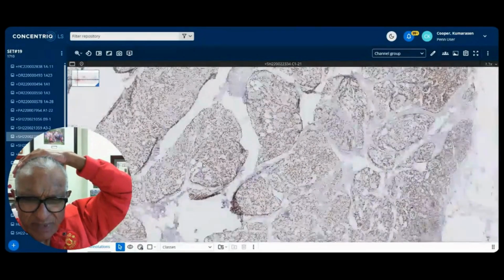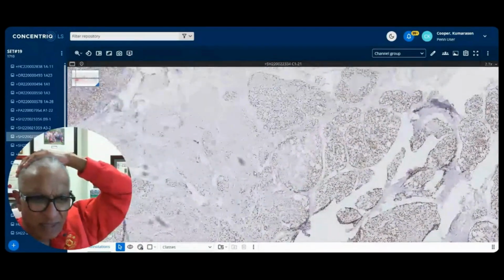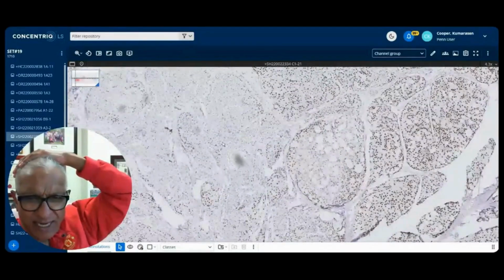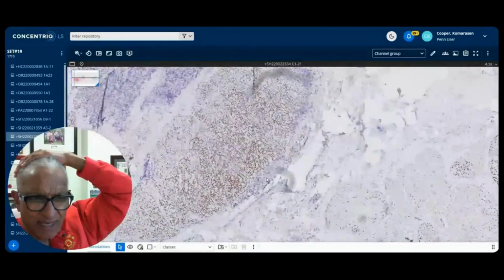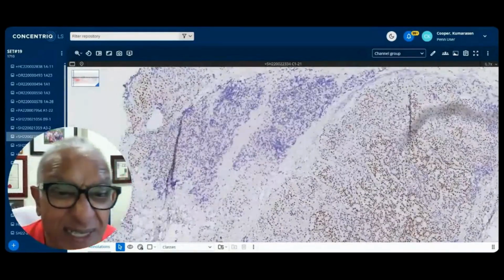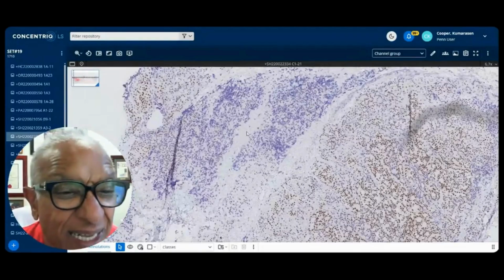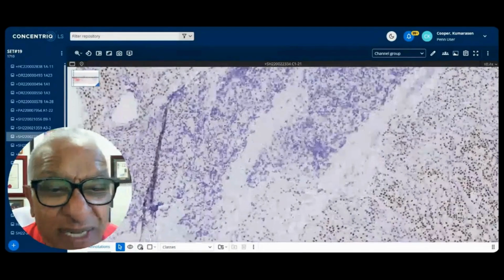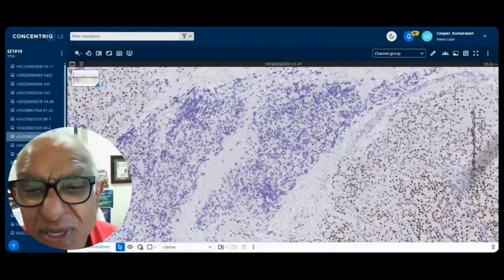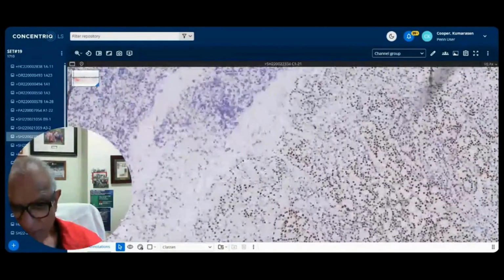So I was glad I scanned this, because the antibody was very new at that time, and I scanned the slide before returning to the files. Here there may be some parotid acini that are negative, and that's why I'm trying to find that for you, because they're negative in the normal glands, normal acini, but they're positive in the tumor cells.